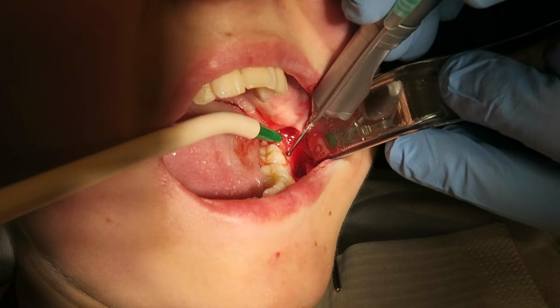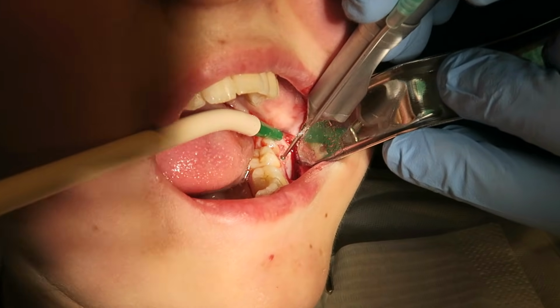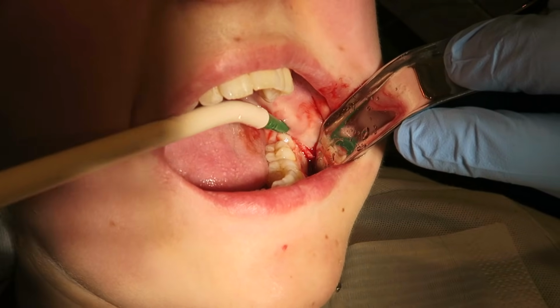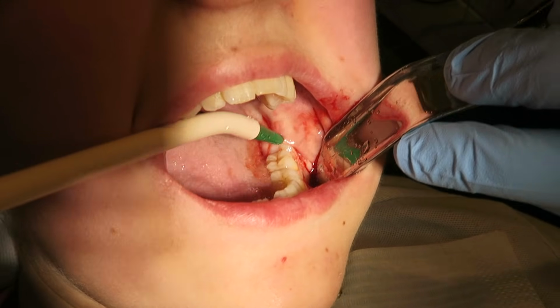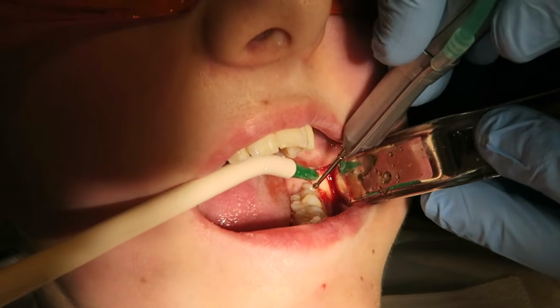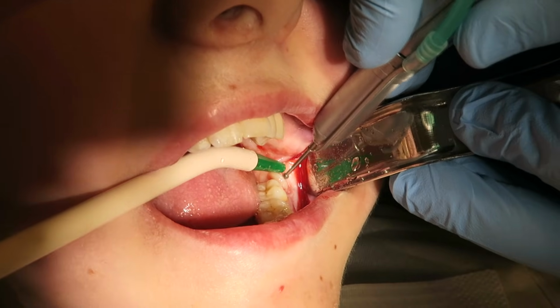Here I use a number 5, 0 millimeter round burr or rose head burr with plenty of irrigation to make a buccal gutter, buccal to the tooth to be extracted. In this case, it's the lower left wisdom tooth.